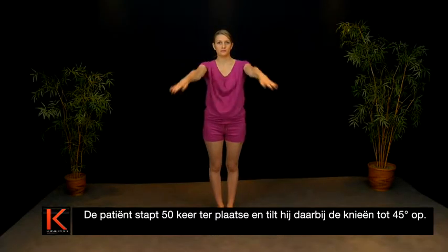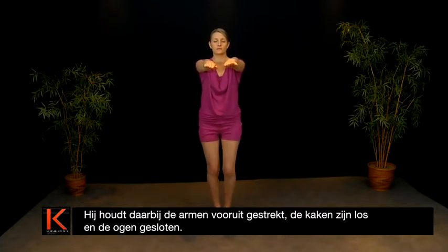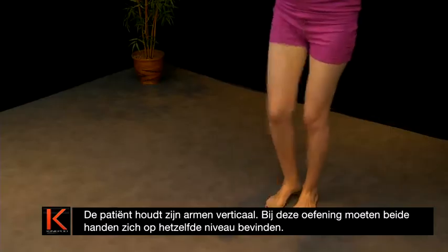Arms outstretched, the jaw loose and eyes closed, the patient takes 50 steps on the spot while lifting his knees 45 degrees. During this test, the patient should not turn horizontally by more than 20 or 30 degrees.